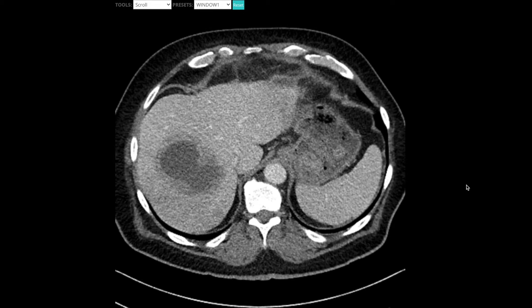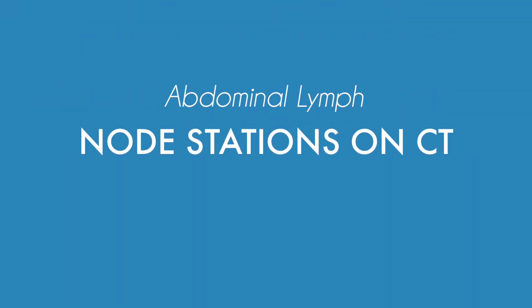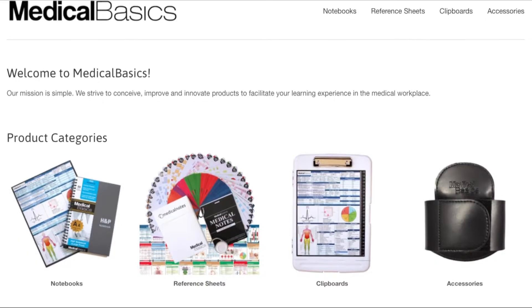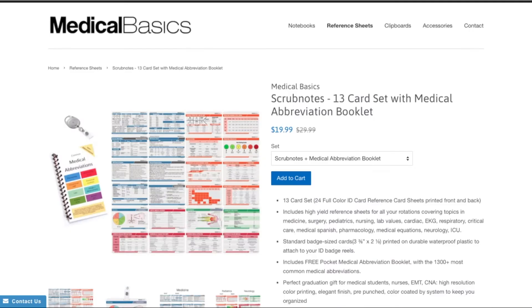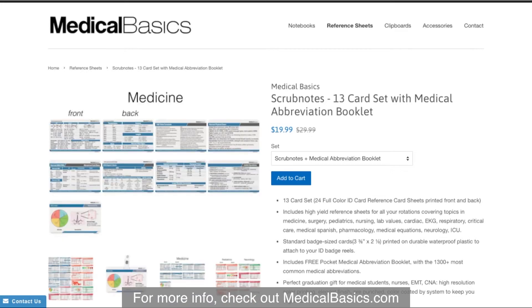In this video, I want to walk you through a very quick overview of the various lymph node stations in the abdomen. For more educational resources like our medical ID cards, check out medicalbasics.com.